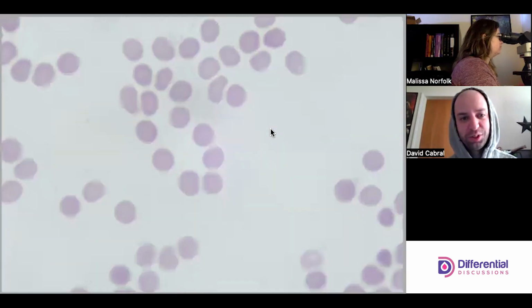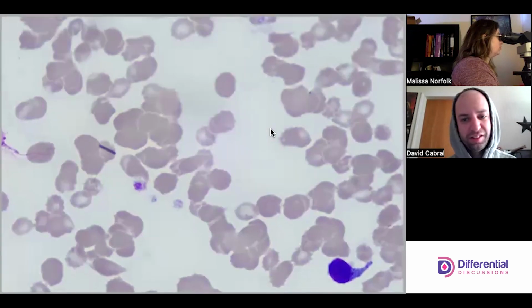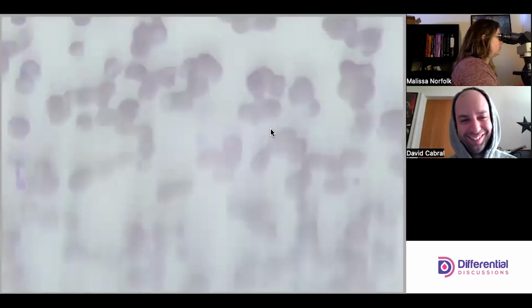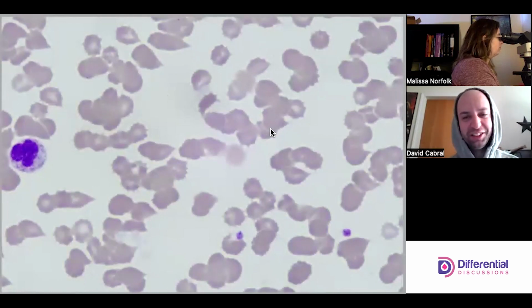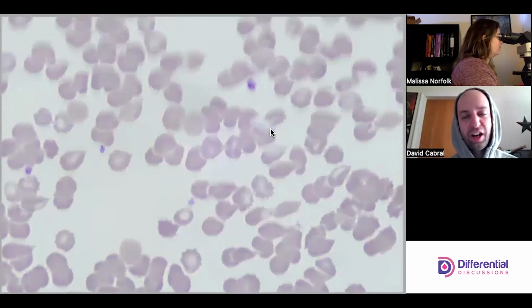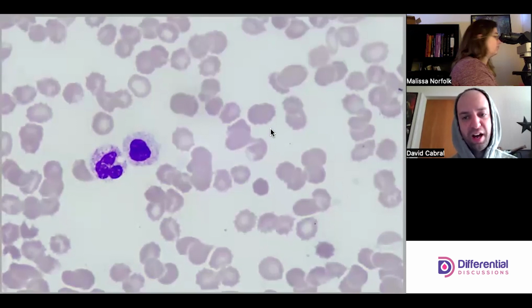The clumps. Weird lymph. And now all of a sudden we're really thick. It really is just a problem that peripheral blood is not meant to have bacteria.